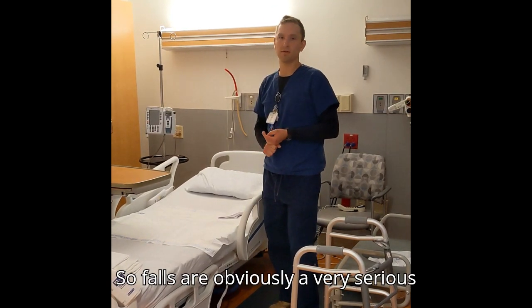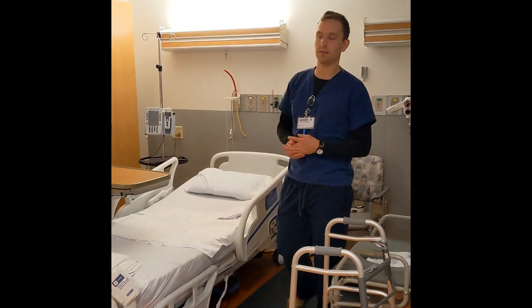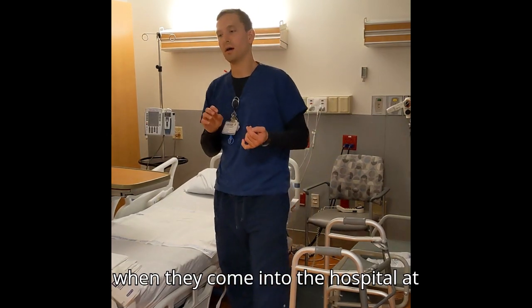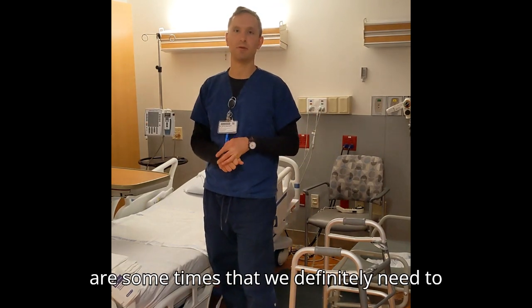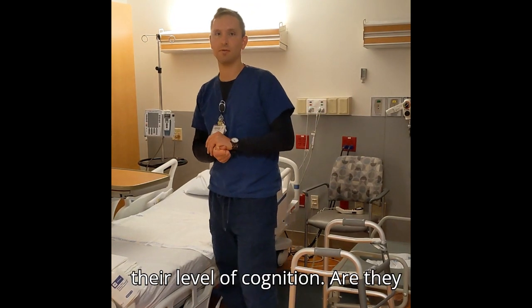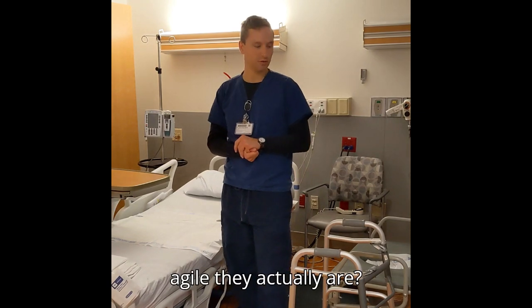So falls are obviously a very serious issue in the hospital. We try to do everything that we can to avoid them. Fall mats do not stop falls, but they blunt the impact of the fall. Falls tend to occur when patients first come into the hospital, at shift change, and in the bathroom. So those are times that we definitely need to be very aware of people's mobility issues and also their level of cognition. Are they aware of where their body is and how agile they actually are?